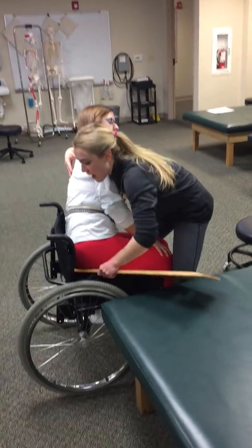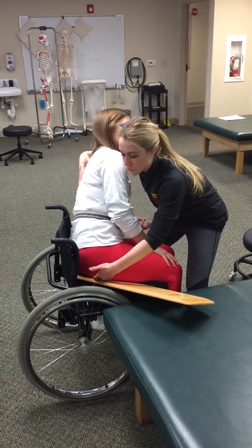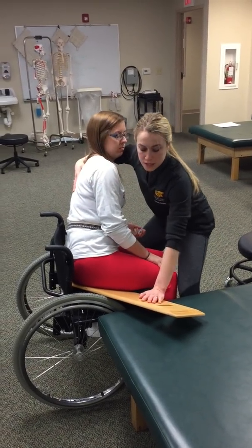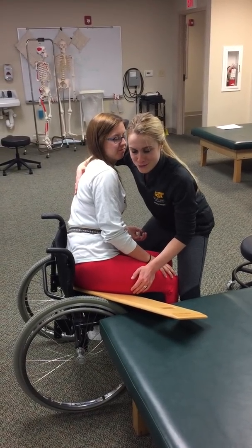I like to start from the back and kind of wedge it in. You want to make sure for sure that it's at least under the first ischial tuberosity and pretty close to the second. If you were doing this with a guy, you would also want to make sure that they have the furniture, as we say, out of the way.